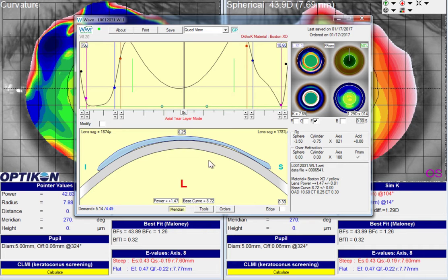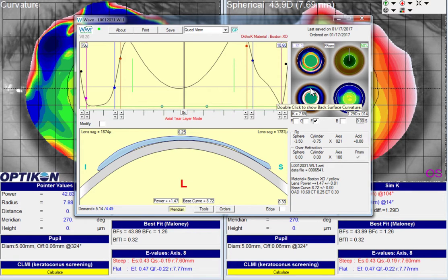At this point, I don't think we need to change the base curve because the initial base curve for the right eye, where that lens is centering very well, seems to have worked just fine. So those are my thoughts on this case — just make that change to the superior quadrant in 50% mode, and hopefully your patient will be doing a little bit better. Best luck with your patient.